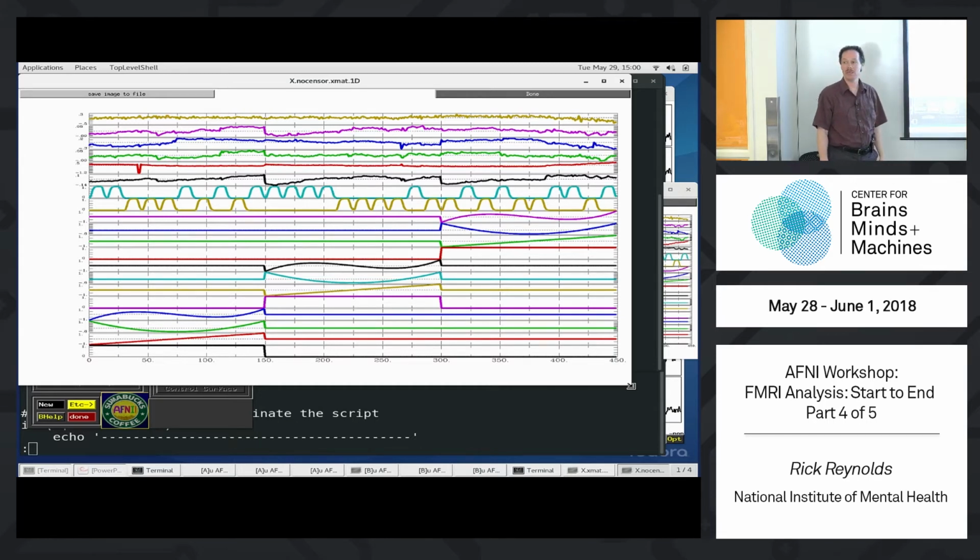Any other questions about that? So we try to put everything in one model for that reason, handling degrees of freedom. Even if you're doing band passing, we put it in this same regression model using sinusoids. Same as using a fast Fourier transform, but that's a slow Fourier transform. You put it in a linear regression model. It takes much longer because it's like having a lot of regressors, but it has the exact same effect. And you can count degrees of freedom.